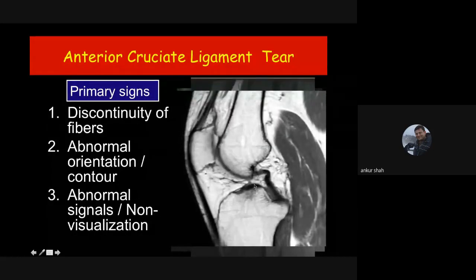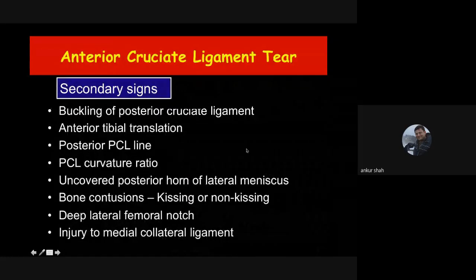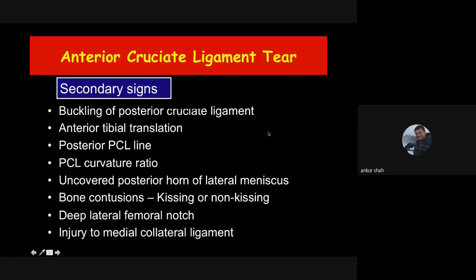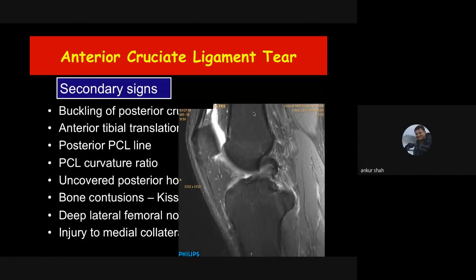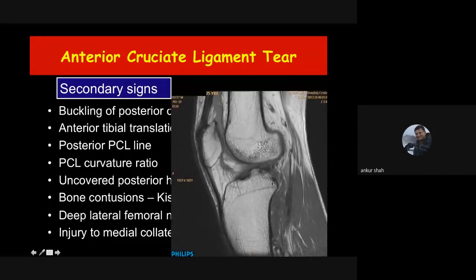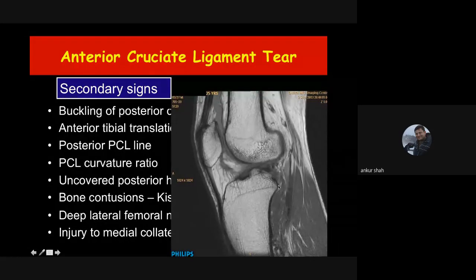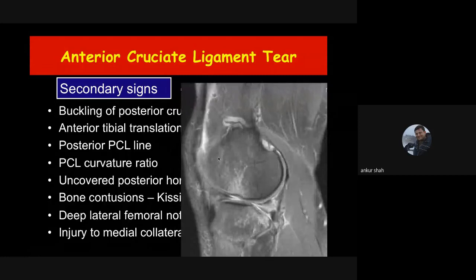Secondary signs suggest high chances of ACL tear but are not 100% specific. These include: posterior cruciate ligament buckling (PCL appearing like a question mark — an indirect sign of ACL tear, so always look more carefully for the ACL when you see a buckled PCL), anterior translation of the tibia (when ACL is torn there is anterior translation of tibia in relation to femur — if the distance between the posterior margin of femur and posterior margin of tibia exceeds 8–9 millimeters, that is anterior translation of tibia).